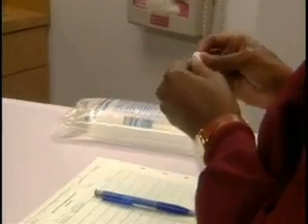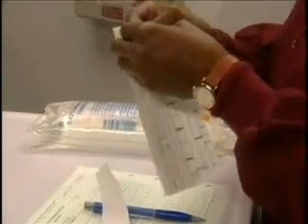And I place the time strip on the solution bag, right? Right. You align it with the volume amount on the solution. Okay. Let's go see the patient. Okay.